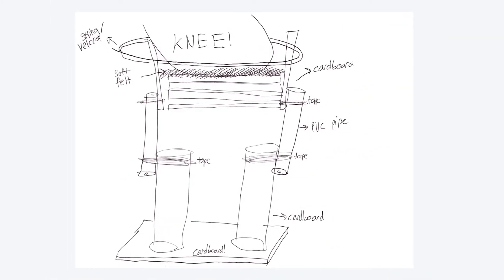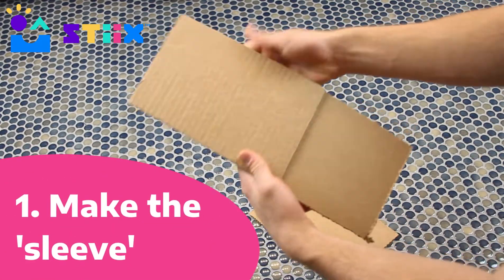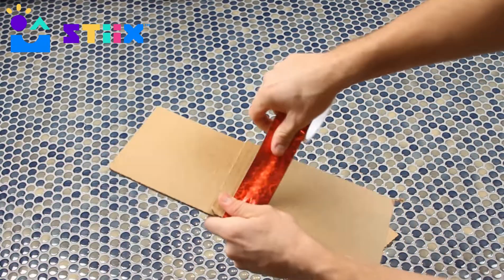Here's what we put on paper before we brought it to life. We first wanted to try to use these cardboard squares to make the sleeve, which is the part that your knee slides into.